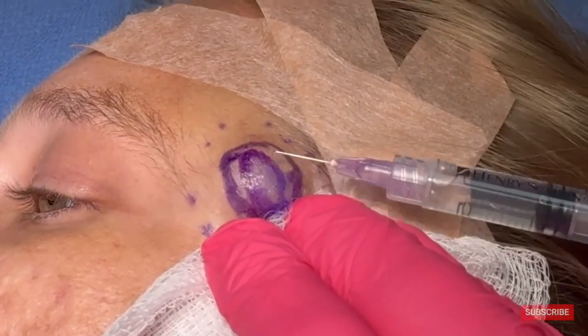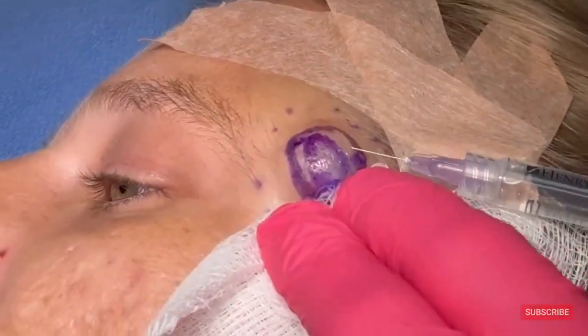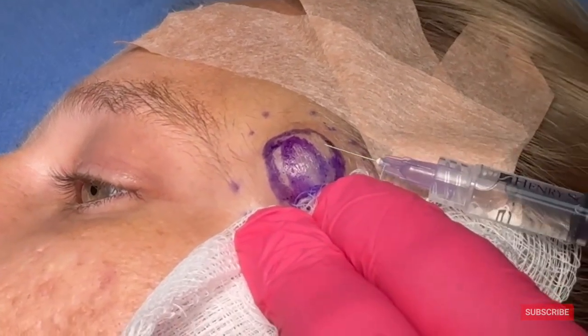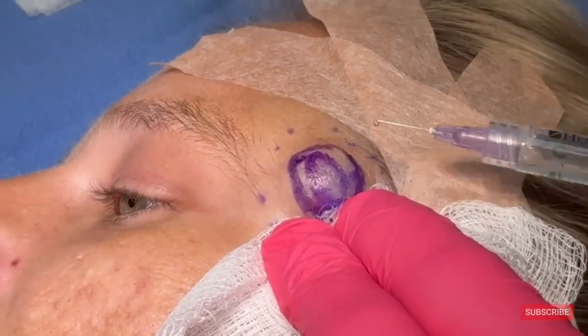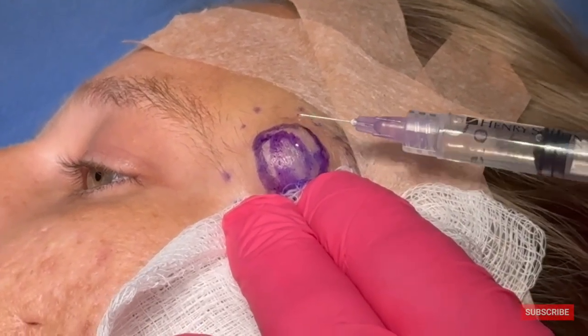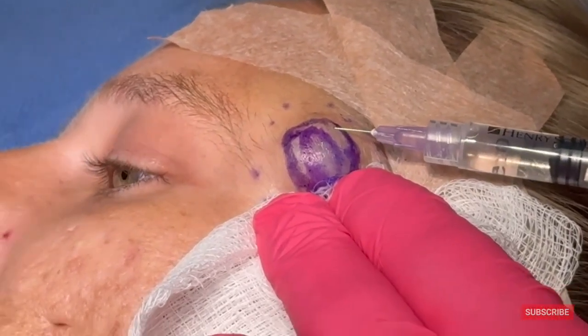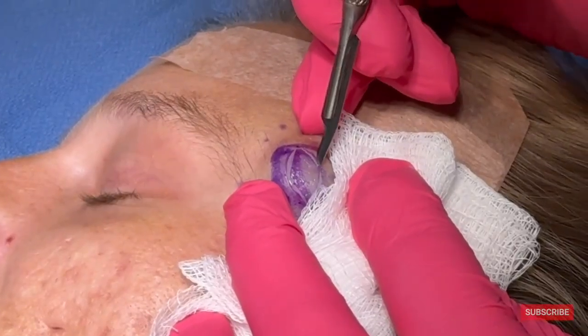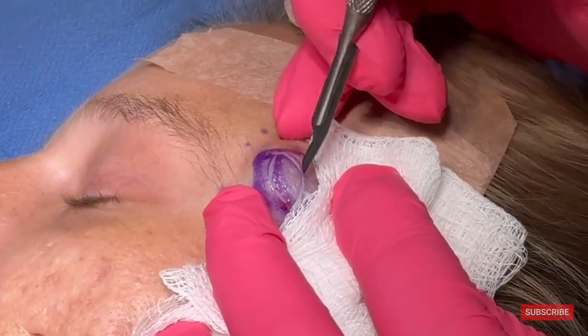Now you could clearly see that's the center of it, right? There's a little punctum, a little opening. That was the original sin: that little hair follicle got infected, and while it was healing, it didn't realize that it was not healing properly, and it made a ball. Keep your eyes closed for this part because we're going to have some yucky, juicy stuff.